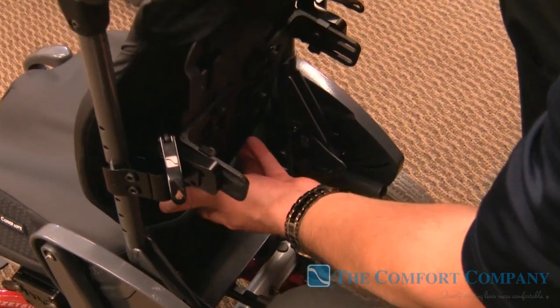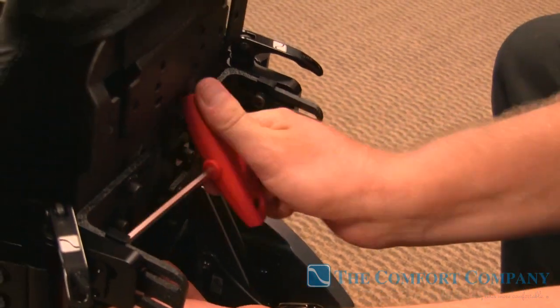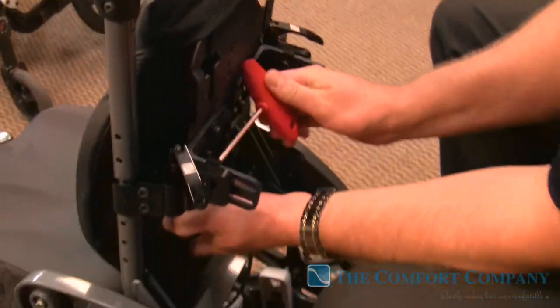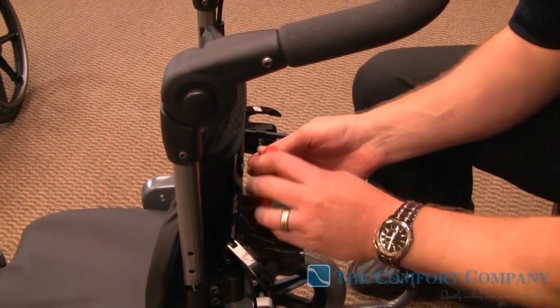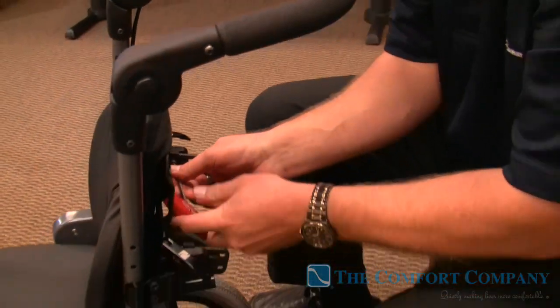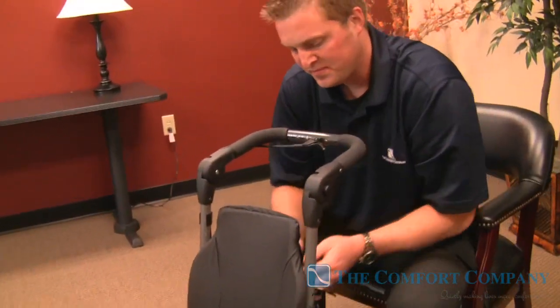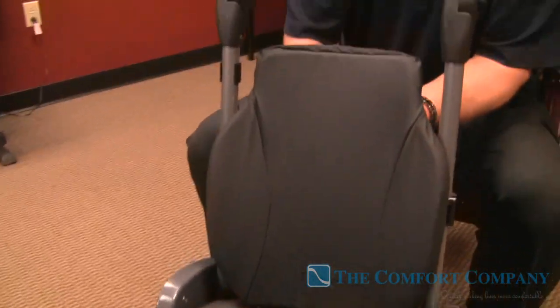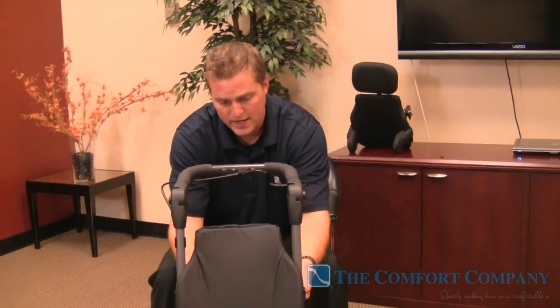Now we have our back height. We can take and adjust our angle — I'll pick the angle right about there and tighten one down. By tightening this down, we have our angle picked, and you can see there's very little movement in the back. All of this can be done while the patient is in the chair, which is one of the great things about this back — everything done with one wrench from the back.